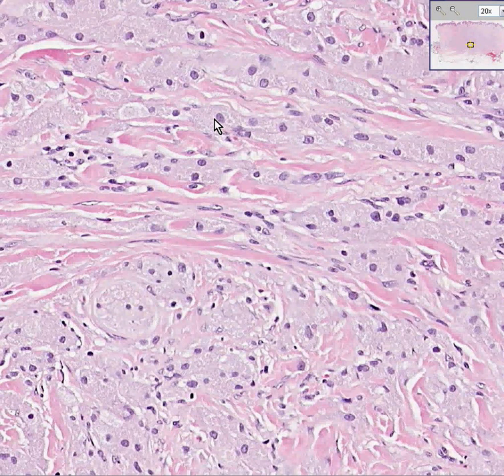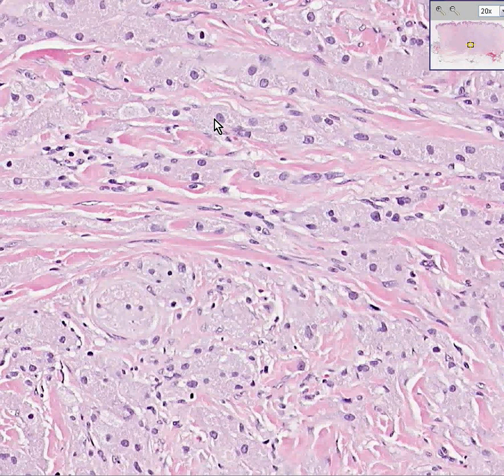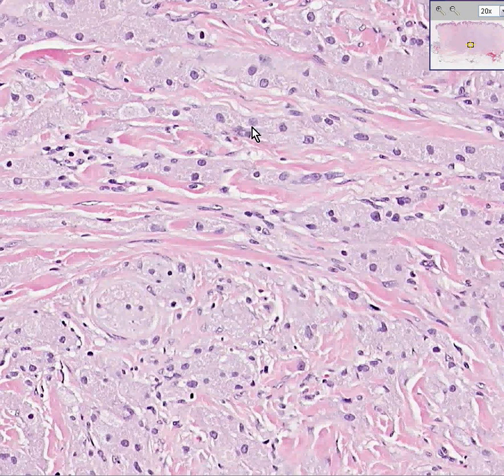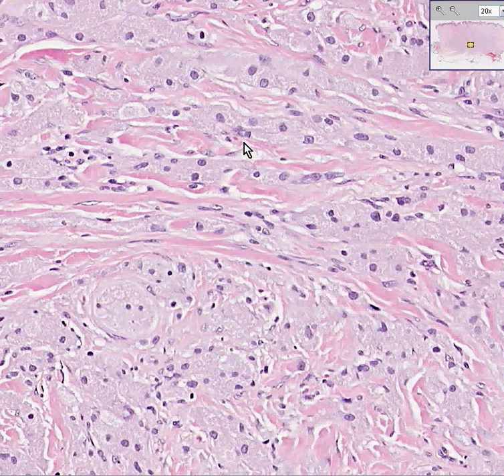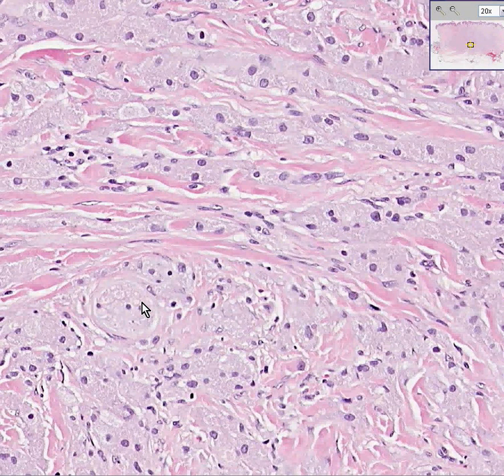If you were to use a supravital stain like methylene blue, however, the granules would be spectacular, and they still can show up here on the H&E stain. For a long time, people thought that these cells were related to muscle cells, so they were originally called granular cell myoblastomas. Now, with modern antigen staining, it looks like they may be of nerve sheath origin, like a Schwann cell, and they have many of the common antigens that Schwann cells do. Nevertheless, they are still called granular cell tumors.